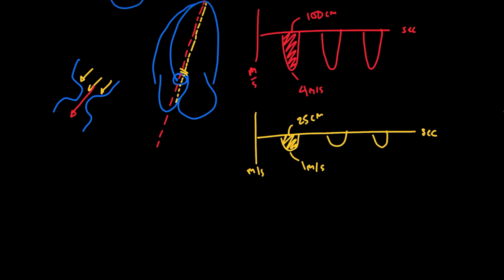And then we also do need one additional data point from our parasternal long view. Got the left atrium emptying into the left ventricle. I've got my LVOT right there, and then my right ventricle, and I'm going to measure this dimension right here. And let's say that, for math's sake, that was 2 centimeters.